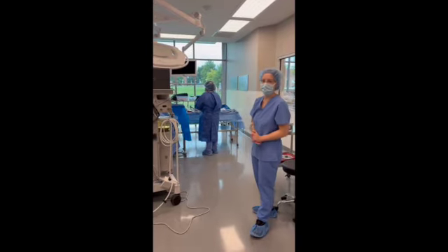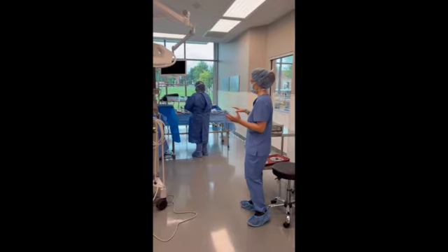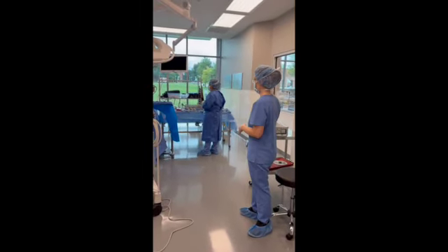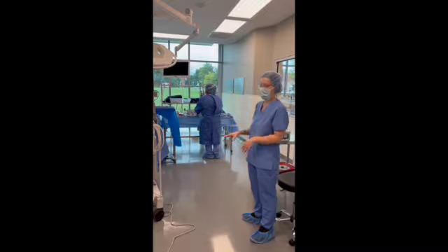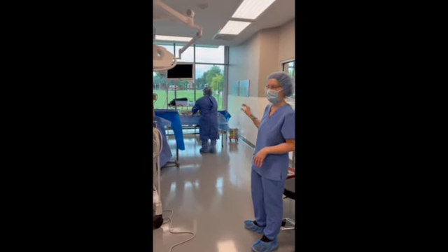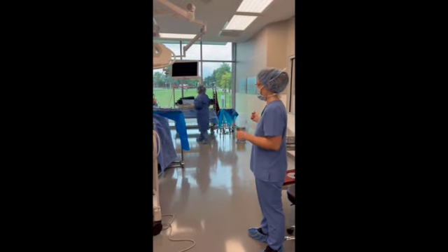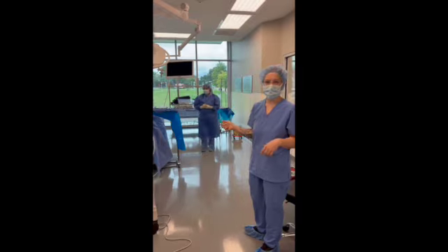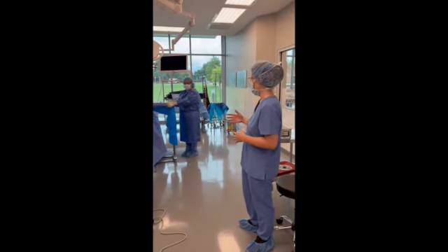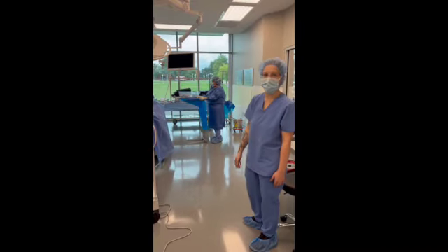So once we get to the post-operative phase of surgery, this is after the incision has been closed. The surgical tech will move her sterile field and sterile items away from the patient in order to keep the sterile field and all of her instruments sterile until the patient is out of the room. Once the patient is undraped and out of the room, that's when we can officially start to break down the sterile field. But until that happens, we want to keep dirty traffic above the head, just like we did during the intraoperative phase.